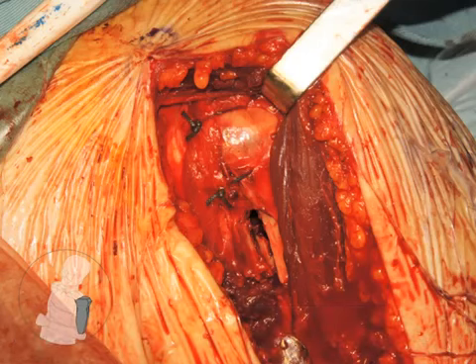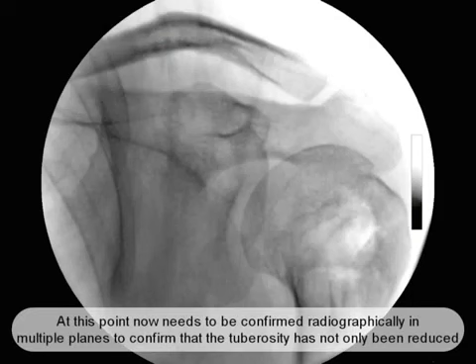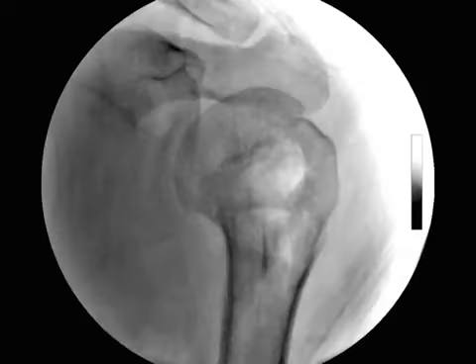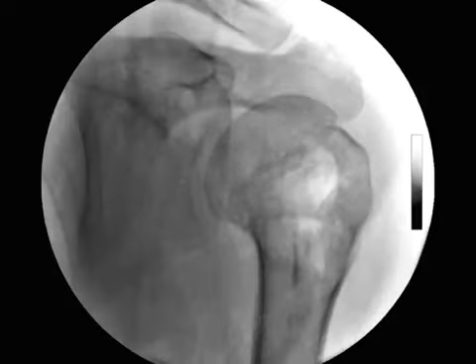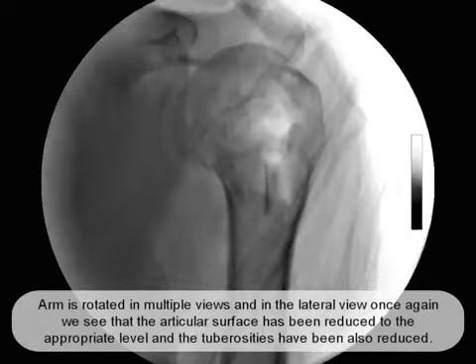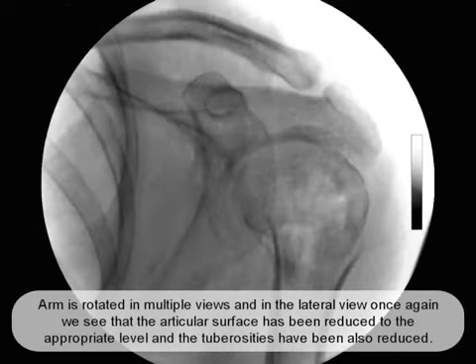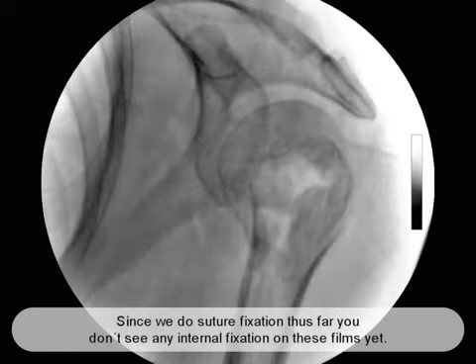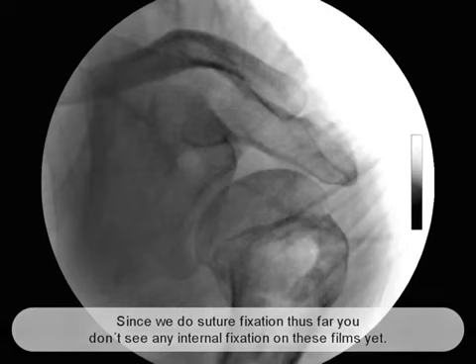Once again showing our reduction and stabilization of the tuberosity fragments, which we can see clinically, and this also at this point now needs to be confirmed radiographically in multiple planes to confirm that the tuberosity has not only been reduced, but the articular surface has been reduced to the appropriate level in comparison to the level of the tuberosities. On our AP view, we see a nice reduction. The arm is rotated in multiple views, and in the lateral view, once again, we see articular surface has been reduced to appropriate level, and the tuberosities have been also reduced. Since we've used suture fixation thus far, you don't see any internal fixation on these films yet.